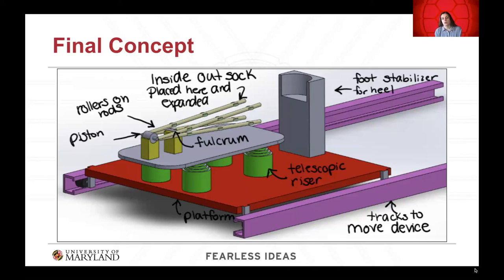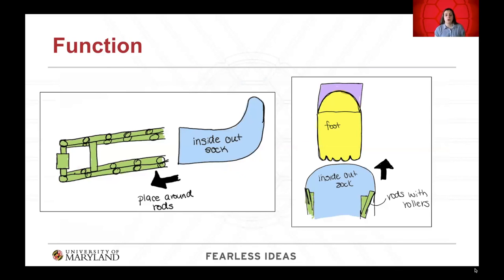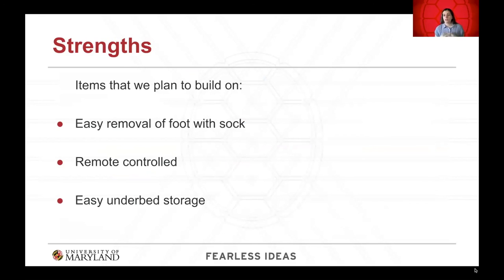This is the final concept, previously explained. Here is an annotated photo showing each aspect of the final design. The device runs on tracks that move out from under the bed. The user places their heel in the stabilizer, and the device moves forward with the inside-out sock until it is completely onto the foot. The sock is placed over top of the rods so that it can easily move onto the foot as the device moves forward, and the rollers allow it to roll onto the foot.